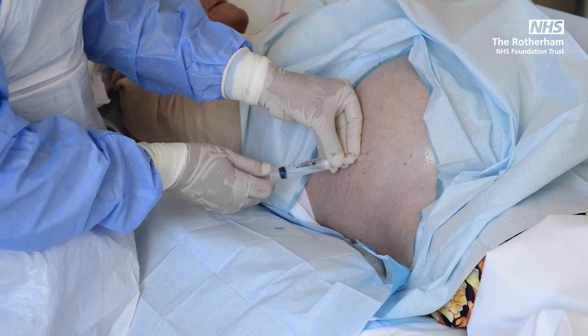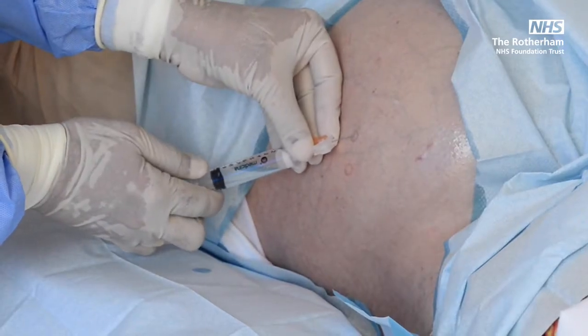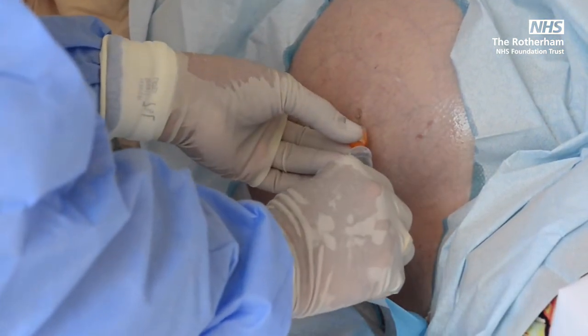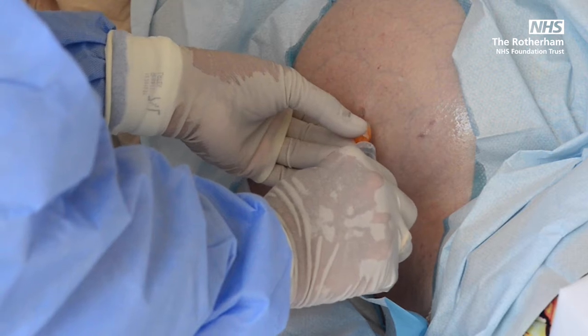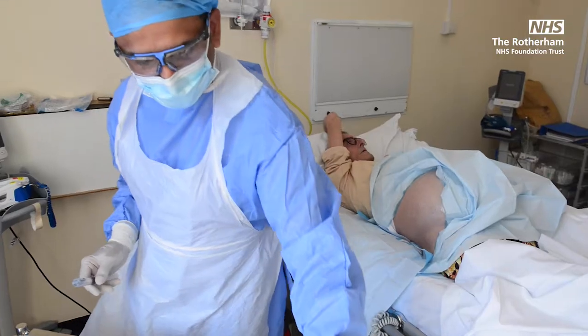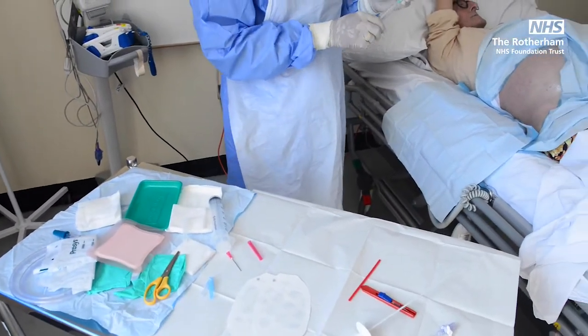Always aspirate to see that you're not in a blood vessel, and then try to create that bleb. Rotate it around. Give some more. So I'm going to give around 2 to 3 mils there. Keep the sharps onto one side so it doesn't interfere with your space.